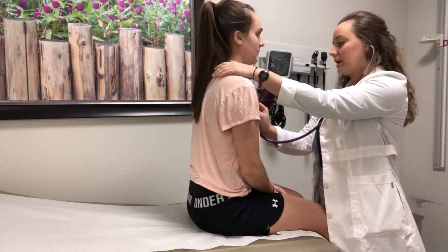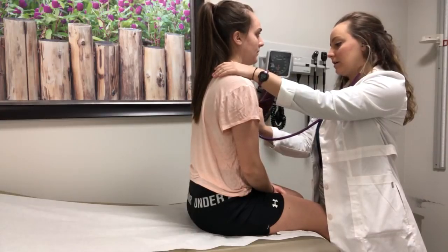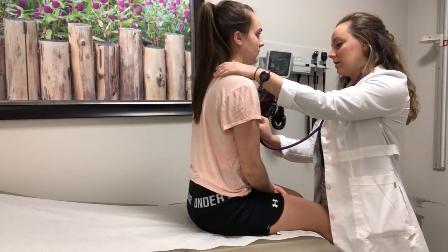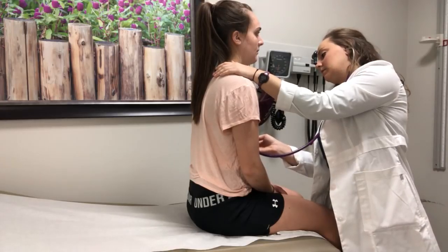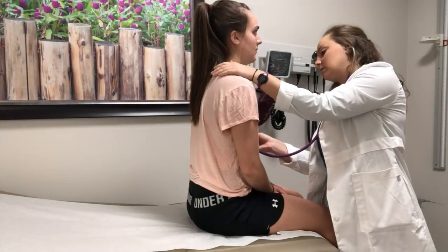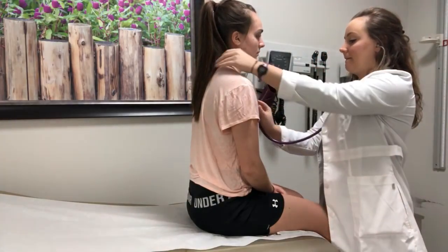So I'm going to go aortic, pulmonic, second pulmonic, tricuspid, and mitral. Okay, I'm going to listen to it one more time with the bell.